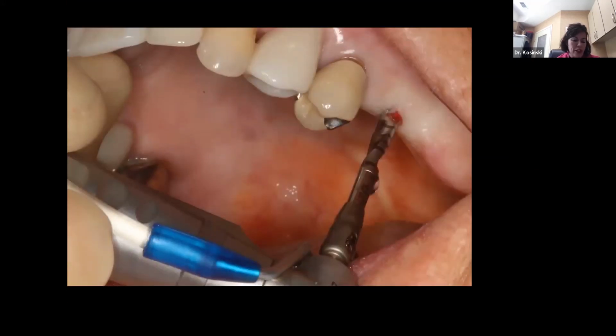We should consider taking a tooth-up approach to implant placement. That means visualizing what the final crown will look like, then idealizing the implant position to maximize the final aesthetic and functional result. Using the Hahn implant system here from Glidewell Dental Lab, I have determined I would like to create an 8 to 10 millimeter wide crown from mesial to distal.